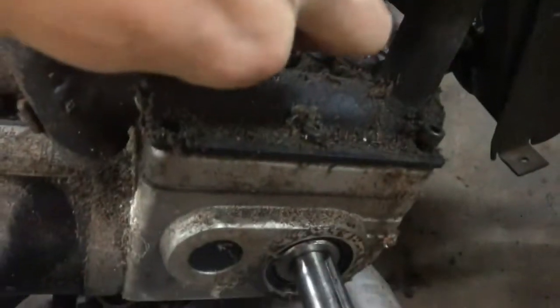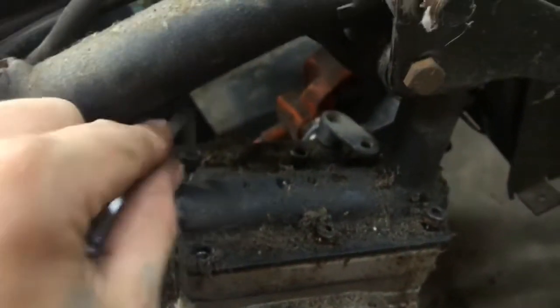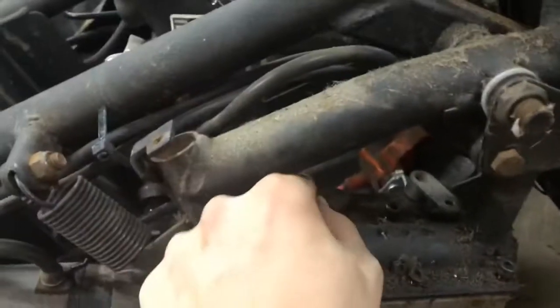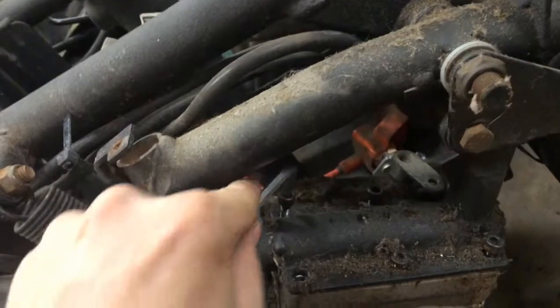Okay, eventually it'll come out by hand. Okay. Almost. Get one more turn.